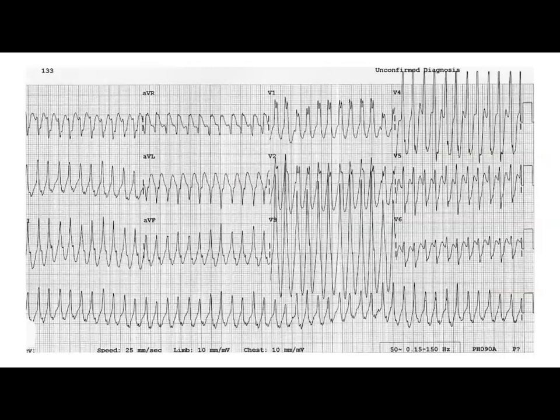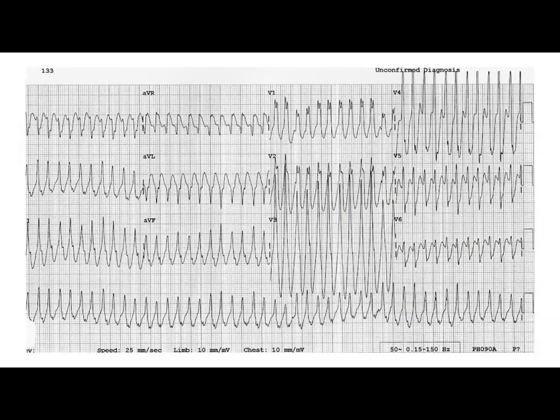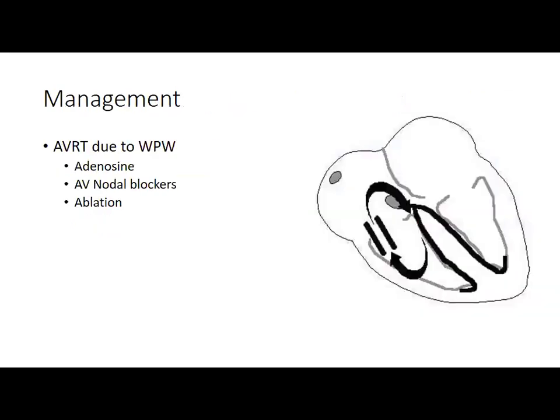So it's really tricky, but worthwhile to familiarize yourselves with the EKGs that look like this. So this is almost 300 beats per minute. This is irregular, starting to get wide because things are going down the accessory pathway. Anything that isn't going down the His-Purkinje is going to get wide. This is going to be wide. It's going to be really fast. It's going to be really irregular. This is where you've got to say, hold on, before we give any beta blockers, we've got to look at old EKGs. Did they have a delta wave? Is there any history of WPW?